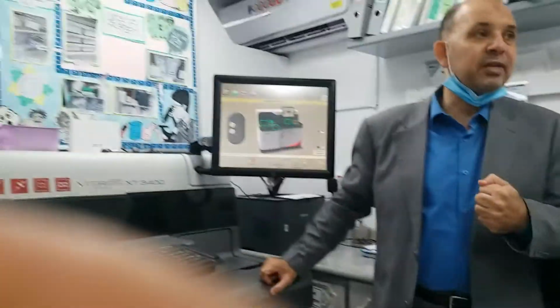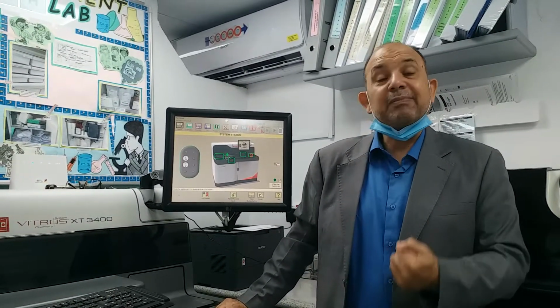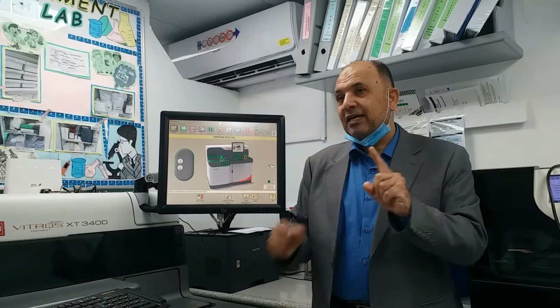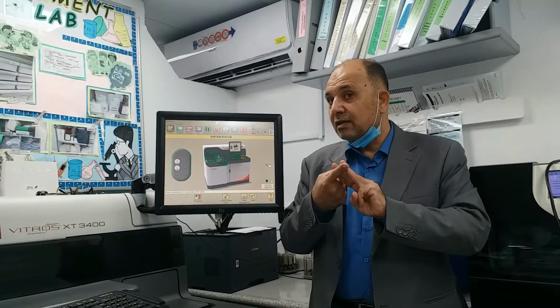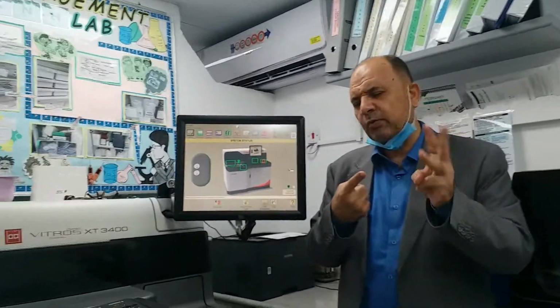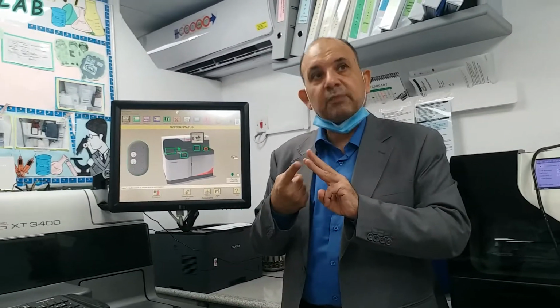Number two, the other one. We call it sample quality assurance. It's not like the quality control we run; it's the quality of the sample. Is it hemolyzed? Is it icteric? Is it lipemic? Bilirubin, yes. The third, turbidity, is related to the lipemic.